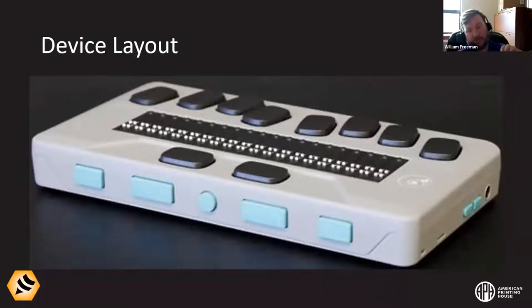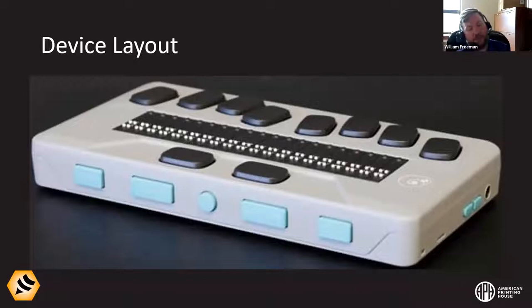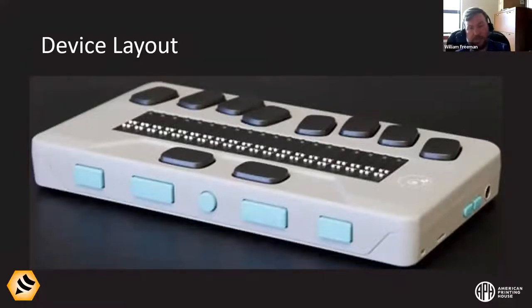Below the volume buttons, there's a small indention in the display — actually two of them. One is for venting and one is the actual speaker. The longer, thinner one is the speaker and the shorter one is for ventilation. The main reason I mention this is the speaker could easily be covered up with your hands. If you're relying on audio, be mindful that the speaker is there and don't cover it.